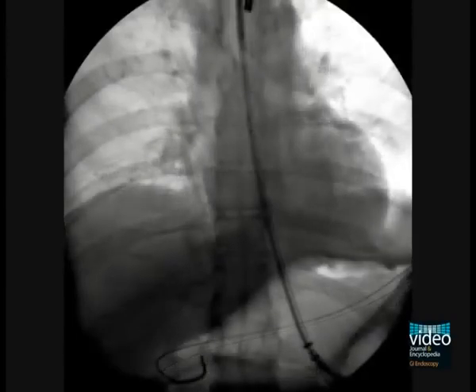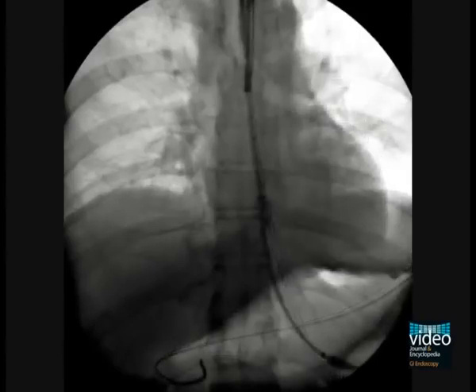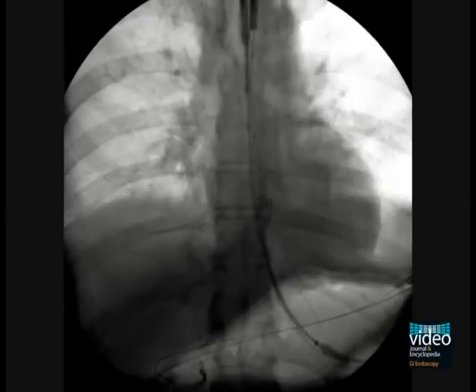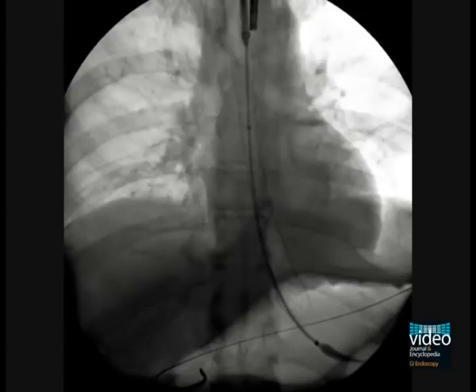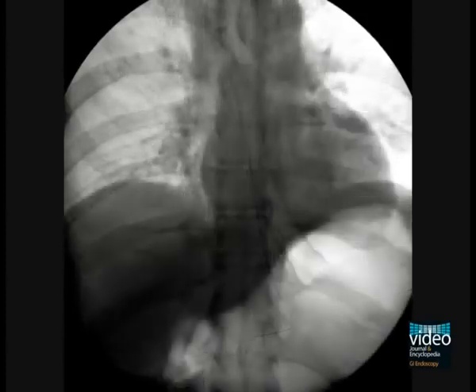Final adjustments are made and deployment is allowed to commence. In this patient the stent is deployed in a distal-to-proximal manner, as is most commonly performed. The stent is fully deployed, clearly bridging the entire tumour. The delivery catheter and its guide wire are then removed from the patient and the stent is left in place, bridging the entire tumour.